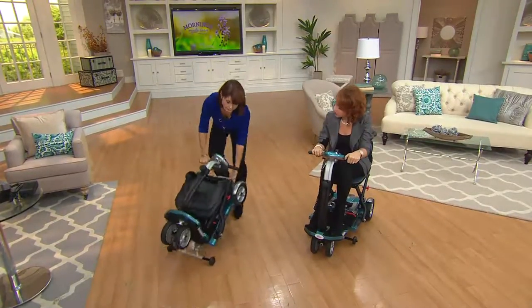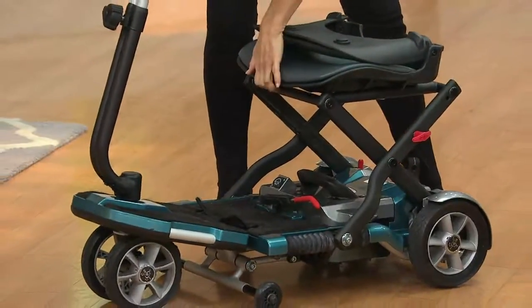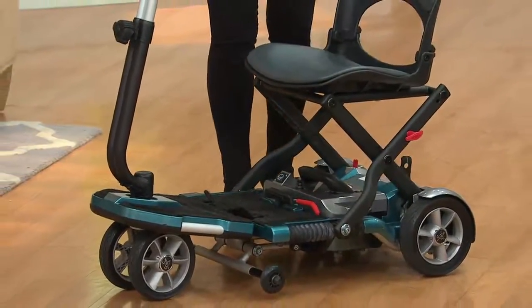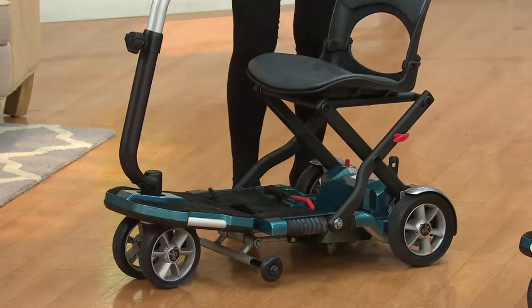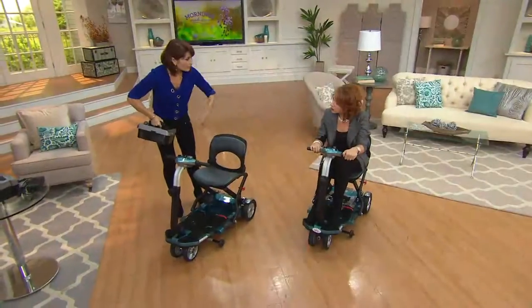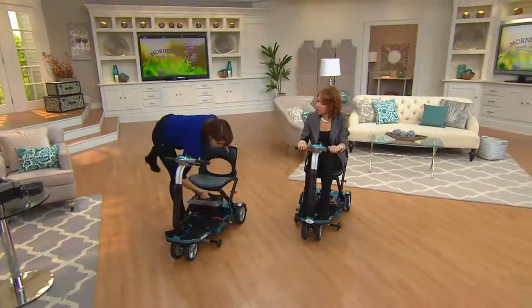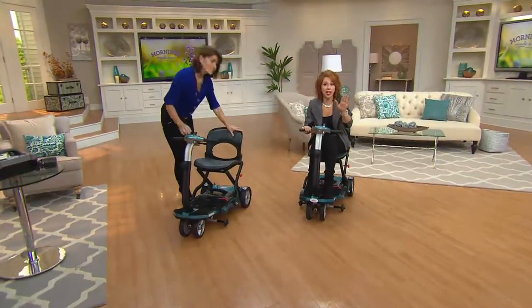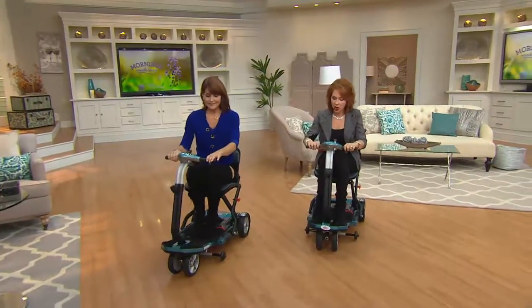This unit together weighs 70 pounds. If you do use this in your car, take the battery out and load it in two separate pieces. The battery weighs 20 pounds and the unit weighs 50 pounds, so you put it in the car in two separate pieces and you don't have to lift as much weight. If you only travel out of the house with it, just leave the unit in your car and you only charge the battery.